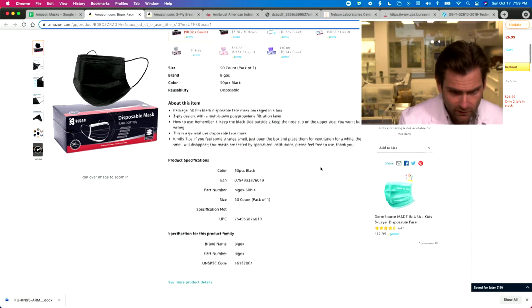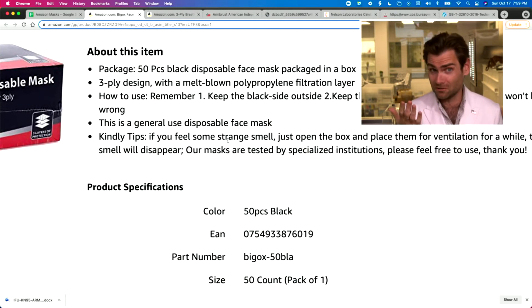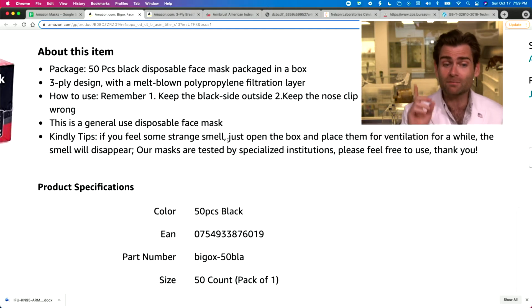I'm going to double-check the listing for any claims. It says: 'Kindly tip — if you feel some strange smell, just open the box and place them for ventilation for a while, the smell will disappear. Our masks are tested by a specialized institution, feel free to use.' But I do have a machine here that does the American testing standard.